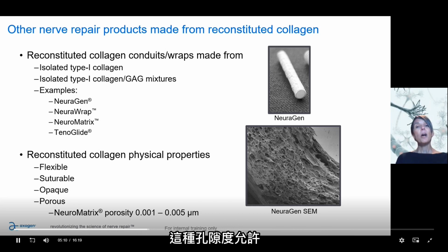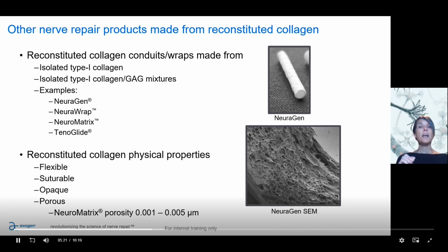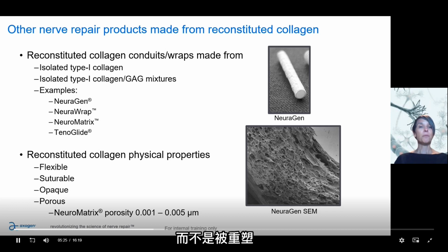This porosity allows for oxygen and nutrients to get into the nerve, but it does not allow the fibroblasts to get in there and start laying down new matrix. So these collagen conduits are degraded by the body instead of being remodeled.